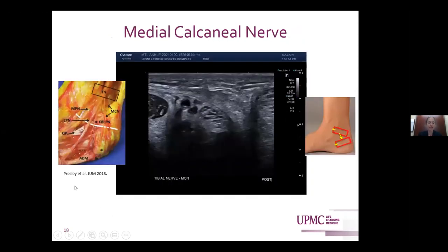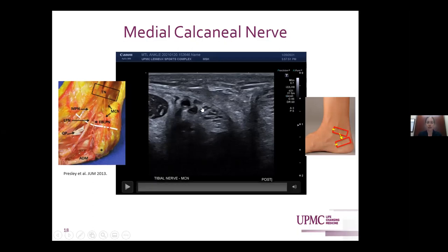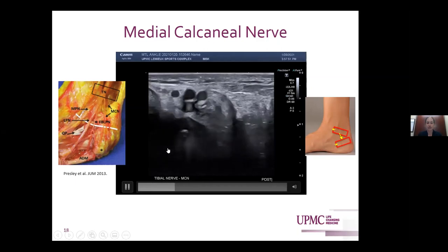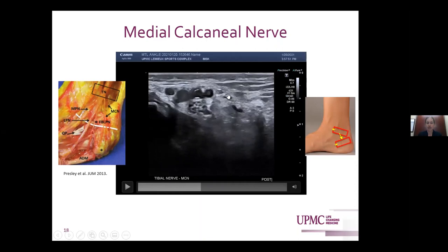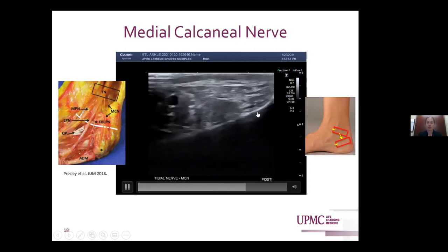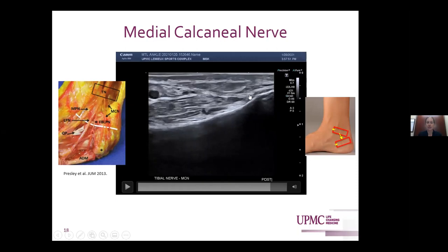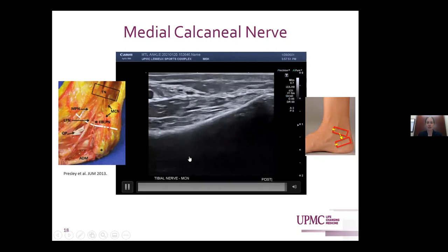For those of you who haven't read Dr. Presley and Dr. Smith's paper on the first branch of the lateral plantar nerve, it was really helpful for understanding this anatomy — it has cadaveric dissections and diagrams demonstrating the course of these nerves. The first branch off the tibial nerve is the medial calcaneal nerve, which is a sensory nerve typically branching proximal to the tarsal tunnel. Following the tibial nerve, you can watch a small fascicle branch off heading superficially over the calcaneus, giving sensory innervation to the skin over the posterior medial heel.